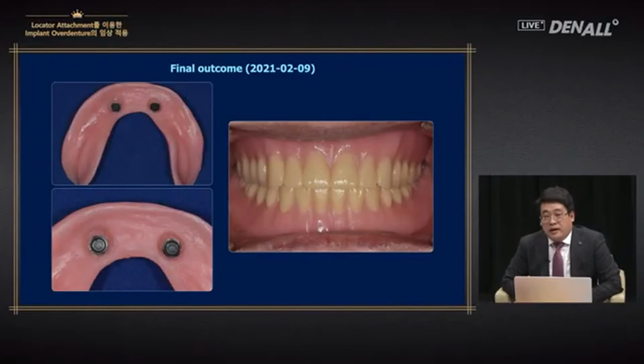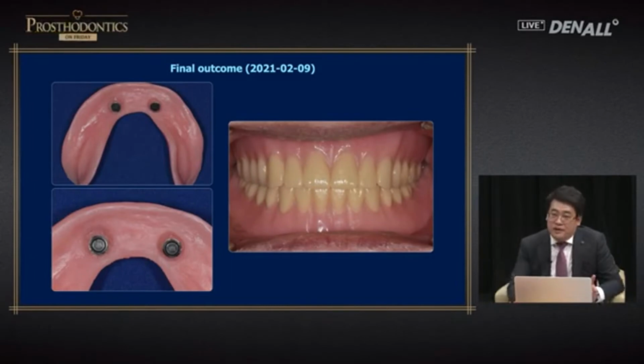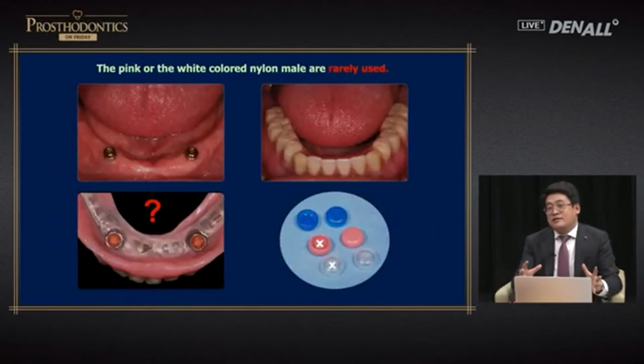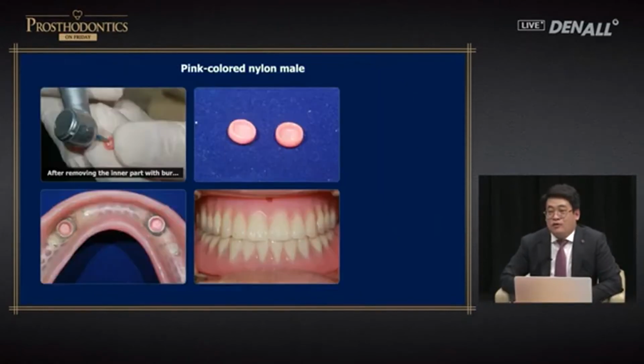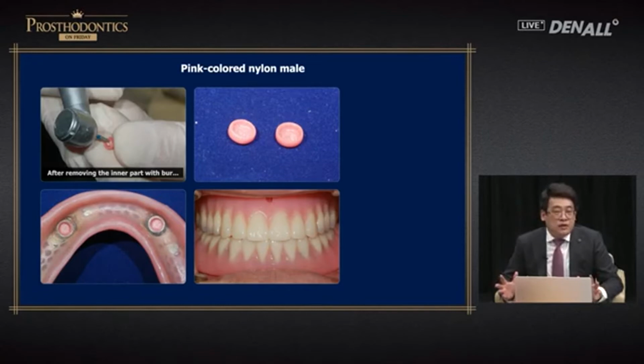As mentioned earlier, I have the patient use the black and then move on to blue. The pink and white continue to pile up, and I wondered how I was going to address these. So I decided to use the burr on the inner surface. I had to give up dual retention because it was too strong. And I started to ponder why the design came to be.